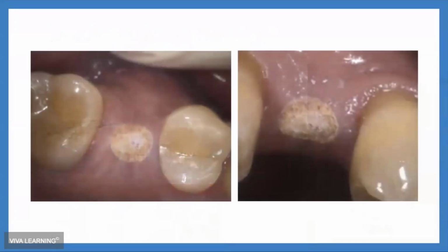So this is one particular technique where we shoot through the guide. We mark the tissue. We burned it, if you will. And you can see that it's a whitish gray look, depending on how hot it got. But that's our marker where our implant is going. So now we can remove the guide because it is very difficult to work through the guide.